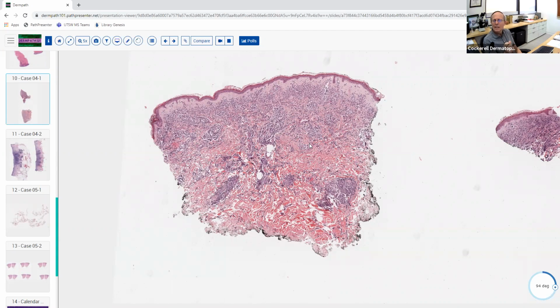If you look at a lymphocyte at high magnification, it's all nucleus, all DNA, all nucleic acids. Neutrophils have more cytoplasm. They don't look quite as dark. Lymphocytes look black, basically, at low power. So these are probably some lymphocytes, but most likely not all lymphocytes. I agree with you. There may be some polys or other cells in there.